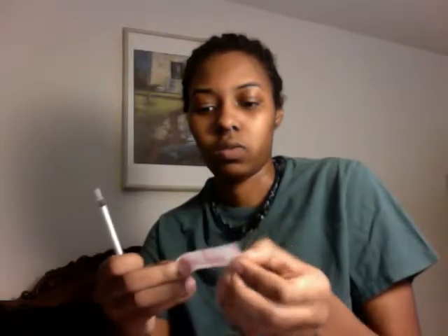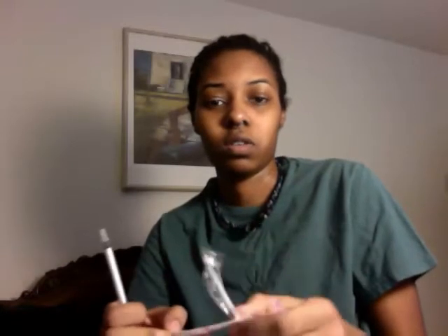Let's put the needle together first. I've already washed my hands, so I'm all clean. I'll open my needle, get my syringe, and get my injection needle ready. The reason I use an 18-gauge needle for drawing is because you can draw the T up a lot faster.